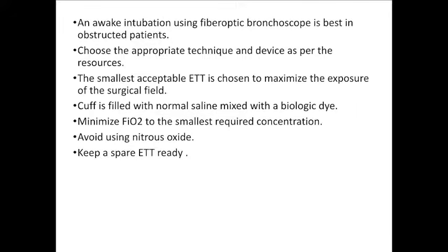Next, choose the appropriate technique and device as per the resources, and the smallest acceptable size of endotracheal tube is used, which will minimize the risk and give good exposure to the surgical field also. The cuff here is filled with normal saline, not air, because air can cause combustion when the laser is used. FiO2 is also reduced and nitrous is avoided, and a spare endotracheal tube should always be kept ready. And there are two types of ventilation.